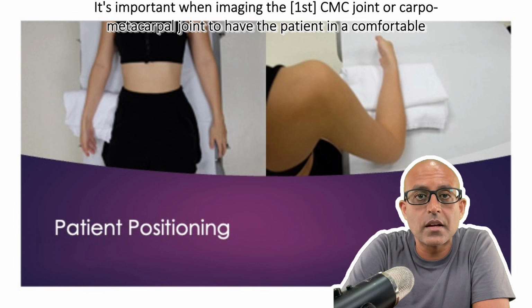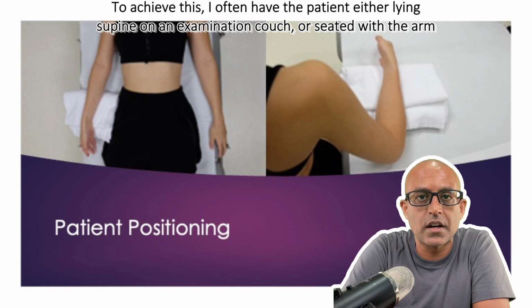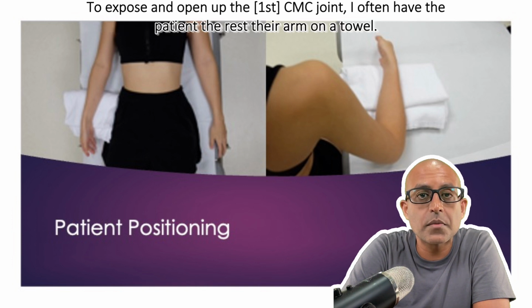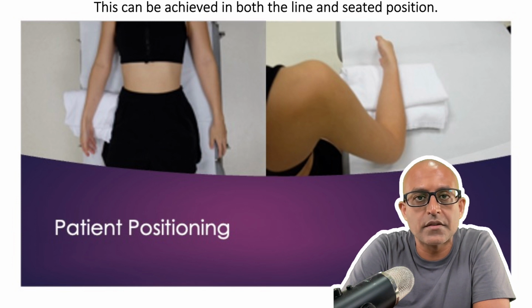It's important when imaging the CMC joint or carpometacarpal joint to have the patient in a comfortable and stable position. To achieve this, I often have the patient either lying supine on an examination couch or seated with the arm resting on the examination couch. To expose and open up the CMC joint, I often have the patient rest their arm on a towel. This places the wrist in an ulnar deviated position and therefore opens up the radial border. This can be achieved in both the lying and seated position.